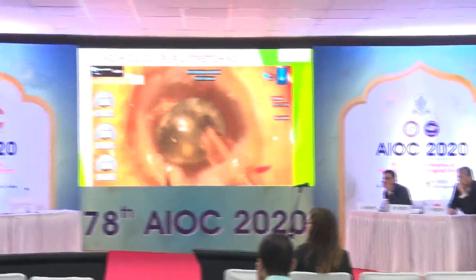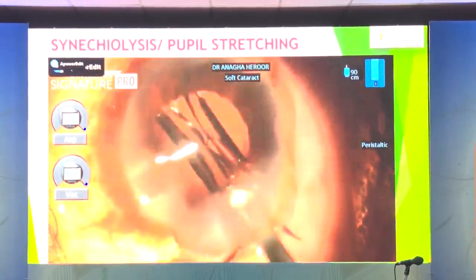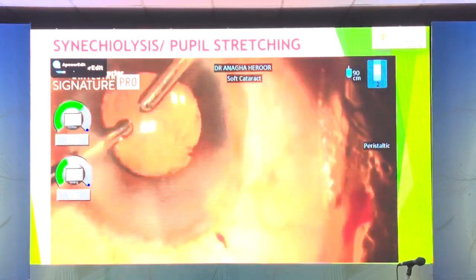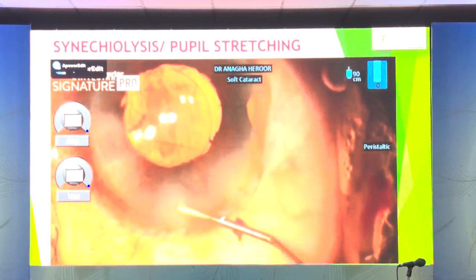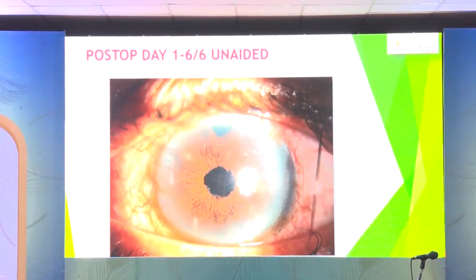Switching to the SCI mode gives a very good glow especially in small pupils — you need good visibility. Sometimes the pupil can still come down during the course of the surgery, so the rexis has to be just inside the pupillary edge. In a patient with old glaucoma surgery, the case went off well, and post-op day 1 vision was 6/6 unaided with a nice round pupil.